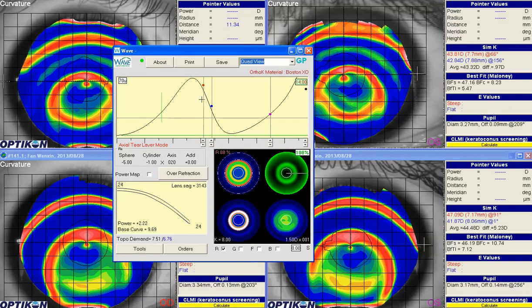Okay. As far as the alignment here where the return curve touches the cornea again, actually it might have been the one before that. We're getting a little bit of clearance here, so it's the first.